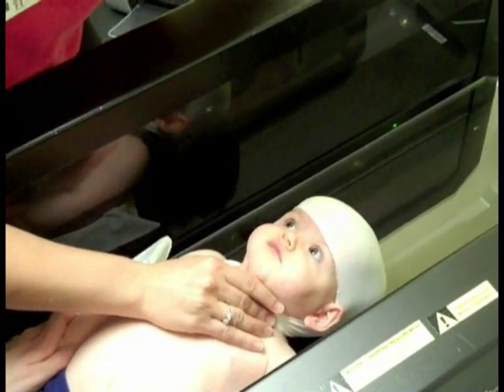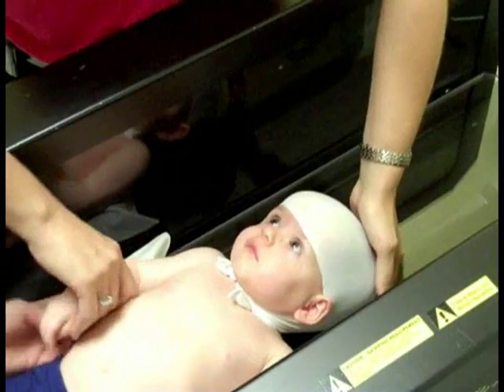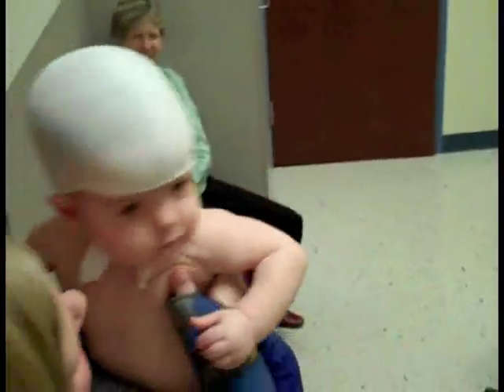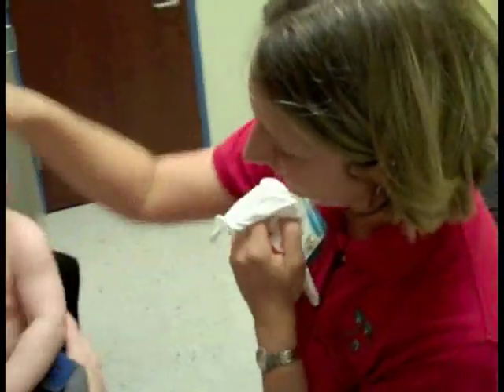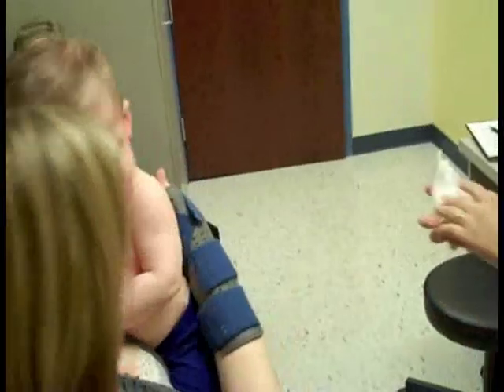The other great advantage of the star scanner is we're able to look at all the measurements of your child's head shape today, and we're actually able to look at them over a continuum of time. We're able to see: does the head shape improve over time? Does it get better? Does it get worse? What's happening? So it's often a tool that we use to make treatment decisions on what's going on with your child and their head shape.